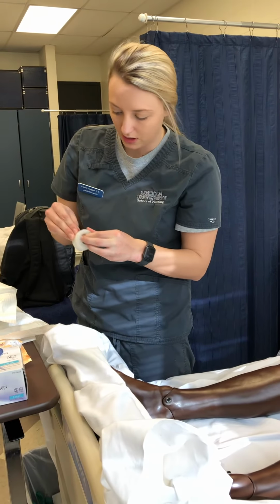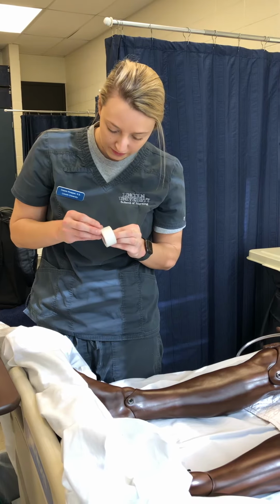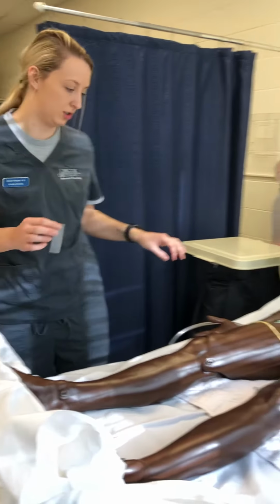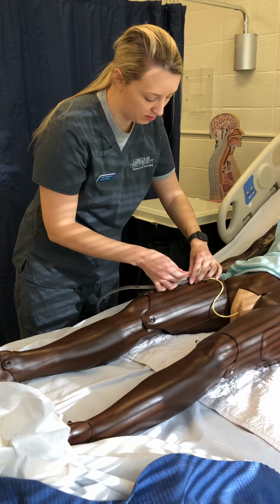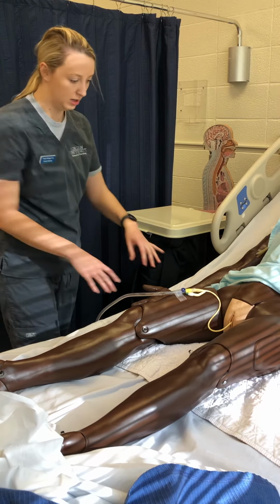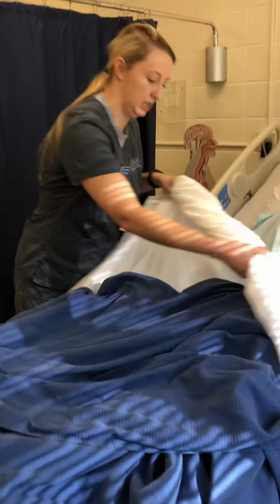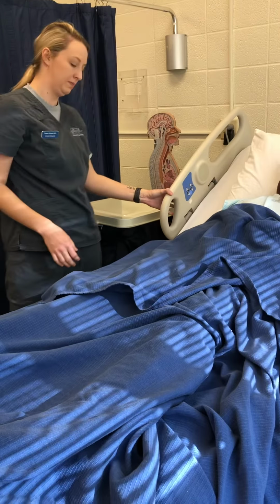The hospital should have clips for each Foley, and I want to make sure it's not super tight. And then I would make sure it's draining, cover my patient back up. Make sure they're not having any pain. Lower the bed back down.